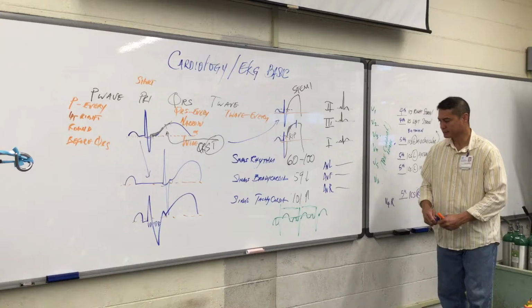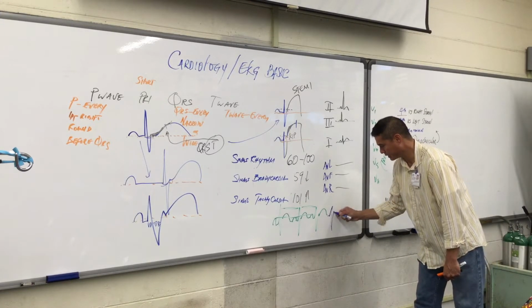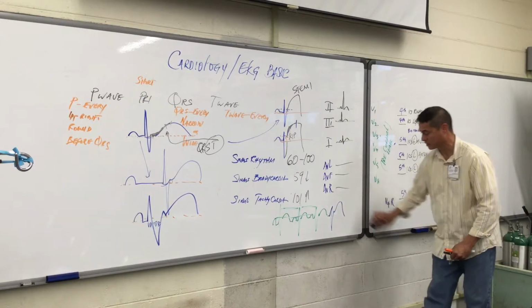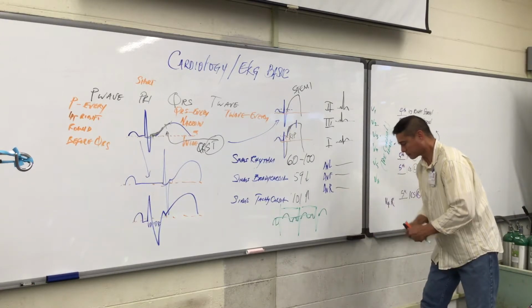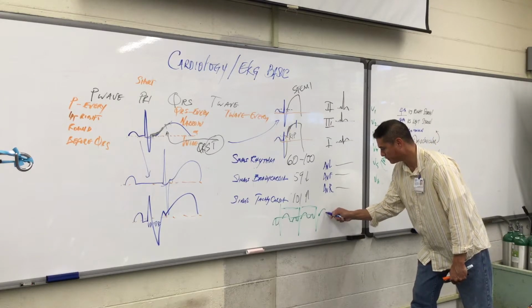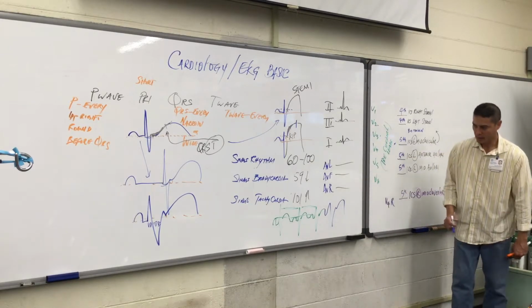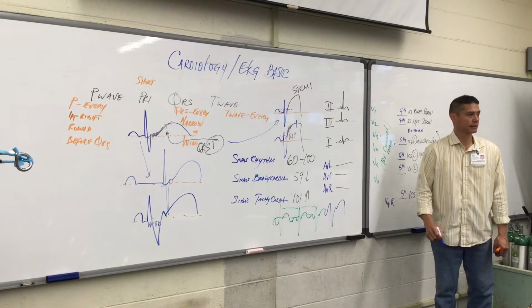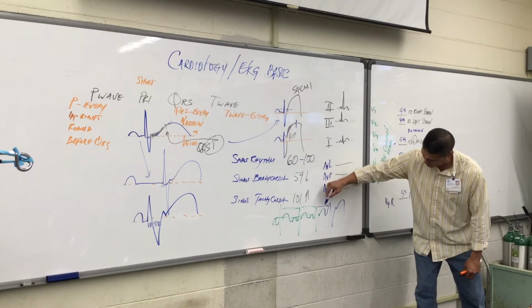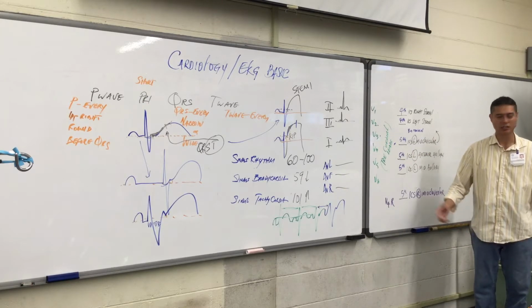In some cases, we may have a shorter, well, I didn't draw that as short as I should have. In some cases, there may be a shorter or earlier beat, because when we measure the length between that complex and that complex, it's too short.